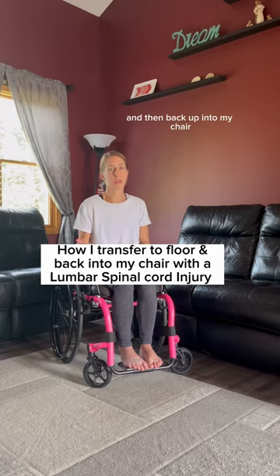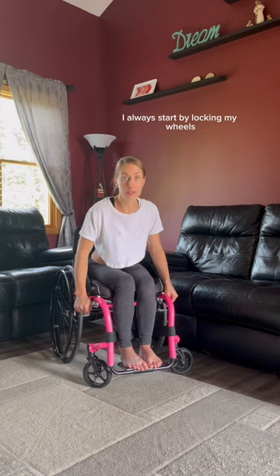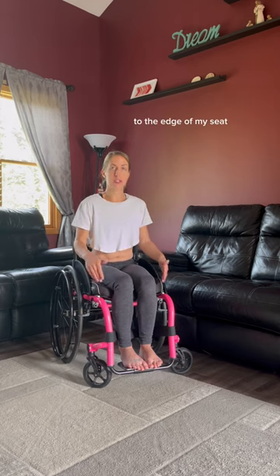I transfer to the floor and then back up into my chair. I'm going to show you how I do that right now. I always start by locking my wheels and then I'm going to scoot myself to the edge of my seat.